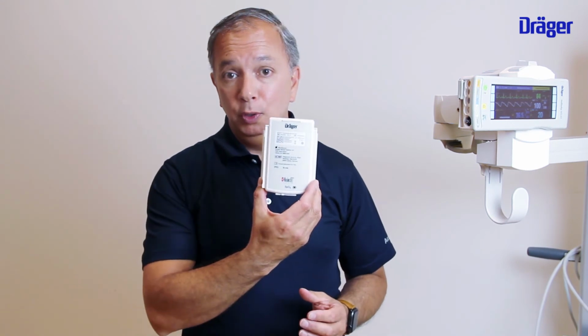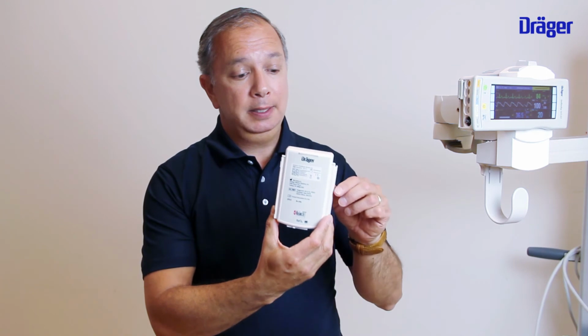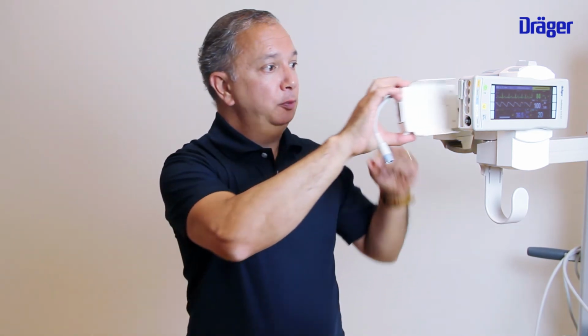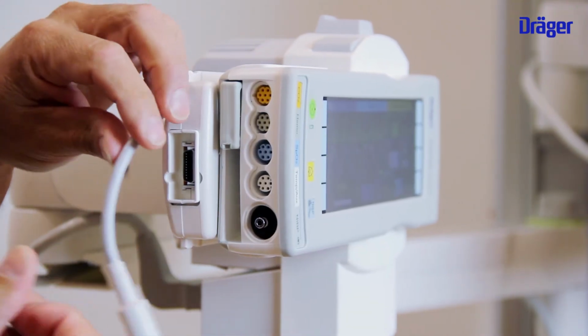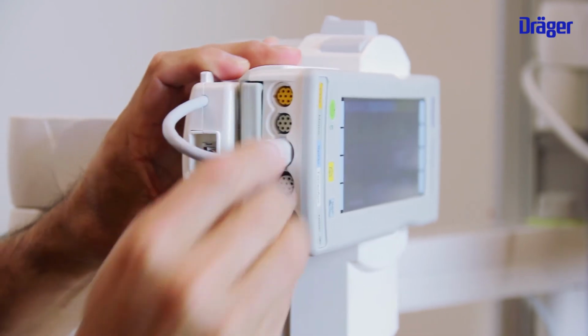This is your SpO2 pod. It comes in Nellcor or Masimo and it has a backpack. So what you do is you connect the SpO2 on the back side of the monitor and you connect the blue cable into the blue connector, like this.